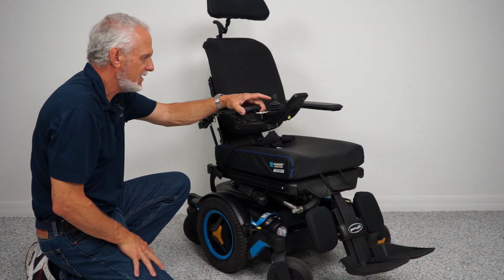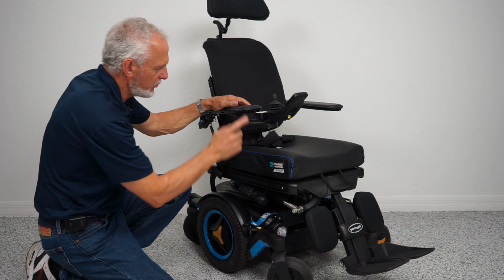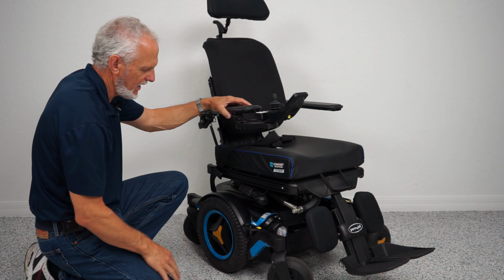So now we're back in gear. And then you got to turn, and the reason you want the power off is you want no resistance in the motor when you put it in neutral and roll it around, okay?